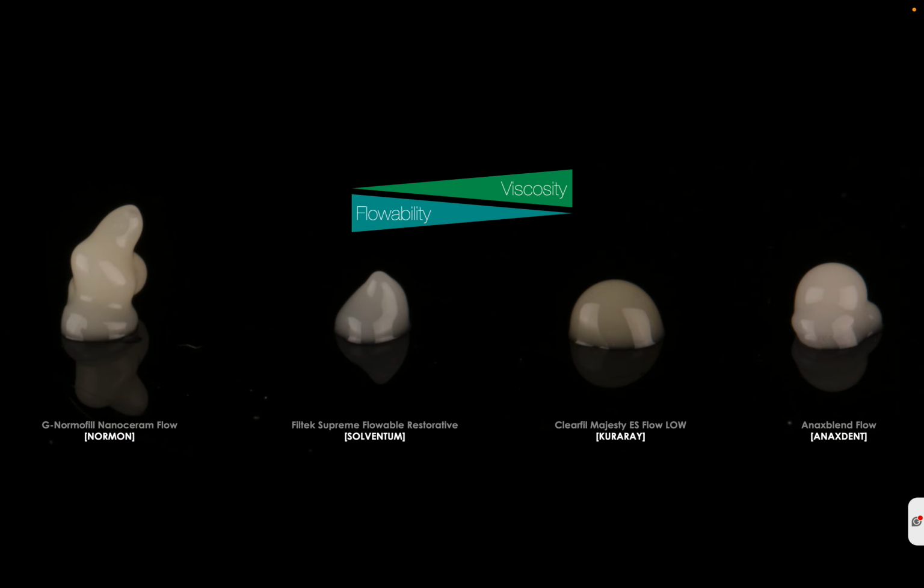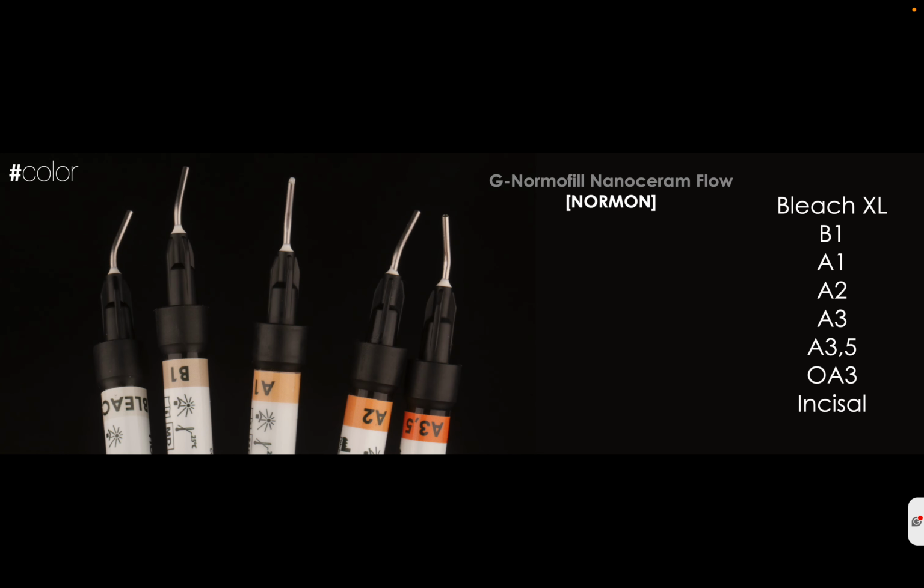So it's important to know that, because the manipulation of this material has to be good, just so as not to have a lot of excess. Normally what I want for that is a good color, good looking, and normally it's between A1, B1, or even the bleach color.